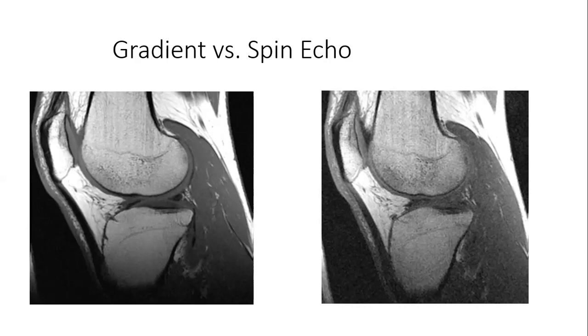So this image is subject to inhomogeneity and the magnetic susceptibility of different tissues. Of course, the protons in different tissues, you are going to have not so wonderful contrast. So it depends, of course, on what we want to look at.